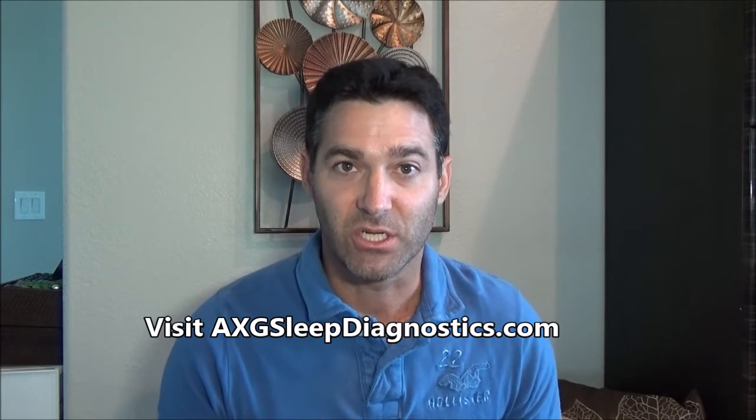With accurate sleep time and accurate sleep staging, one, it diagnoses you accurately, which really is the goal of this entire thing. Why do it otherwise? And it also opens up the door for different options for therapy. Recently I did a study on a pilot who's already on CPAP. What we found is that he doesn't have to be treated with CPAP, but instead can be treated with something called positional therapy, which is just fancy for you can stay on your side and all's good.